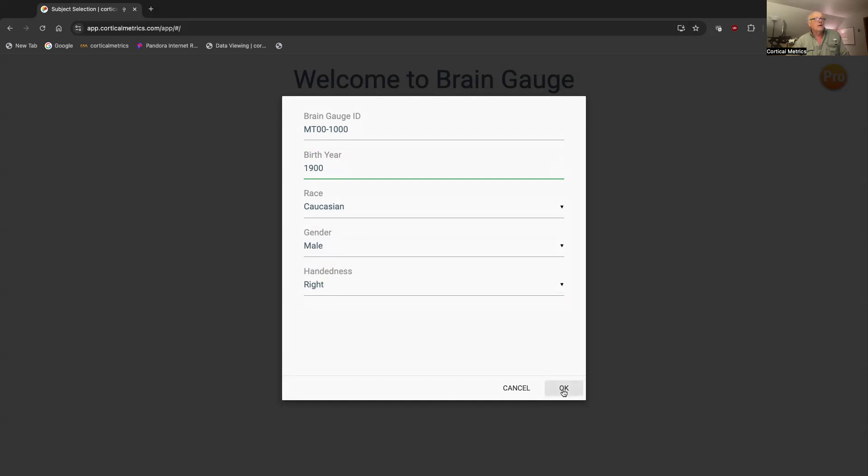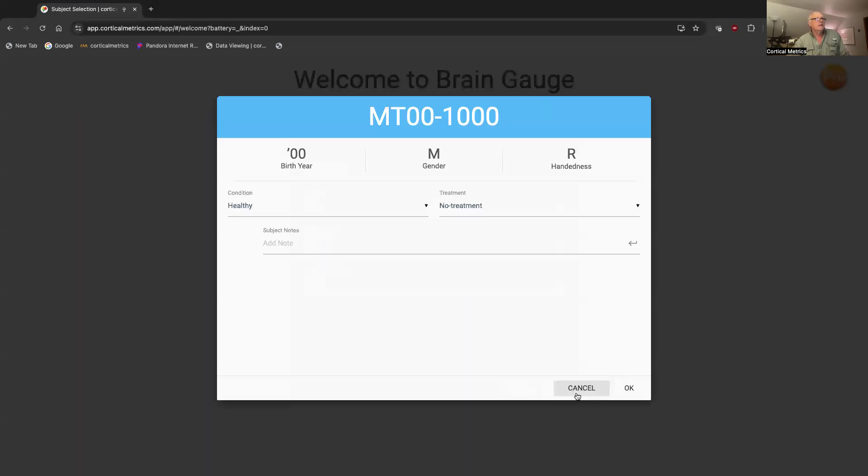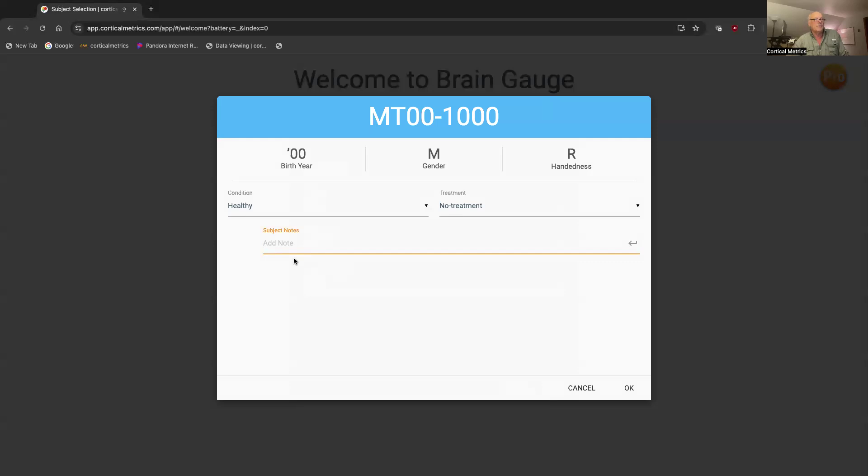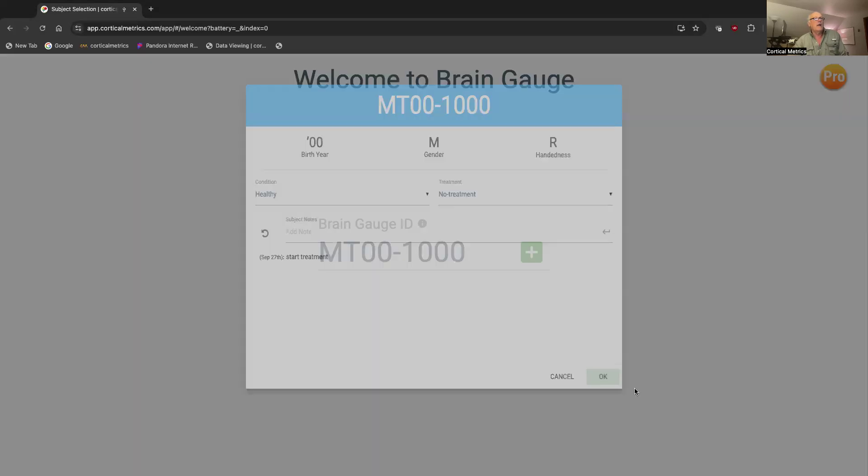Then I'm going to click OK. If you don't enter any notes, you can enter some subject notes. You can say first time testing, you can say start treatment, whatever you want to say. Hit return to make sure it gets entered, so start treatment gets in there. And I'm going to click OK.